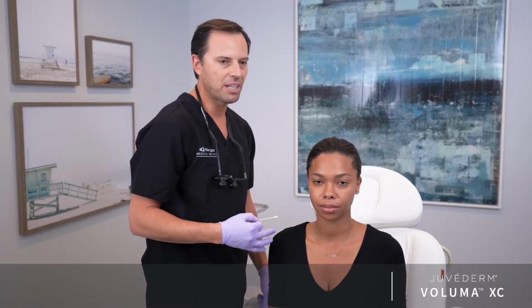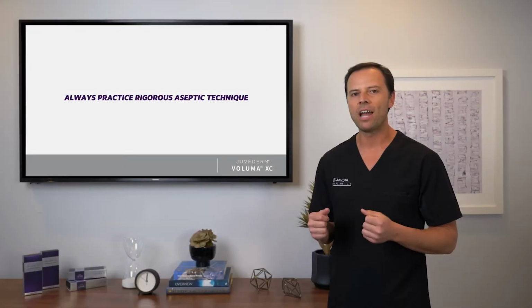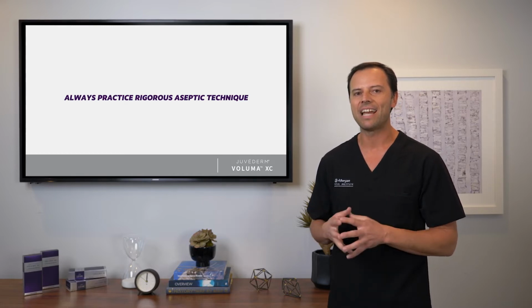And finally, we see some shadowing of the mental crease on both sides and some lack of definition along the prejowl sulcus areas here. And we can use Juvederm Voluma XC using a blunt cannula to address those areas of concern. One final thing before I inject today. It's also important to always practice aseptic technique.